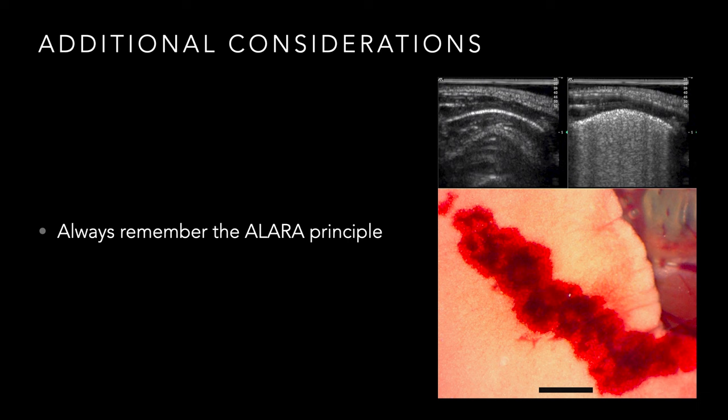But it illustrates what I think is interesting with this ALARA principle: ultrasound is not completely benign. It's generally considered safe. Safe enough that we do it on ourselves, we do it on our patients, we scan with it, but you probably shouldn't be scanning for hours and hours in the same spot, right? So it has implications for training sessions, but it's something to be mindful of.